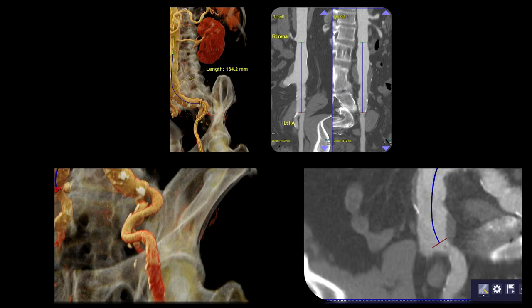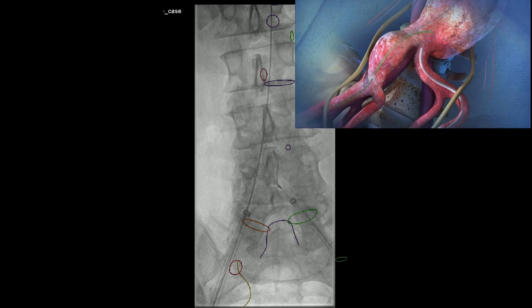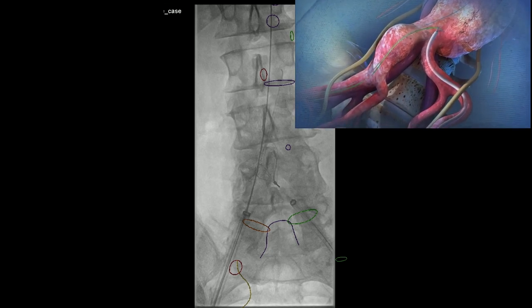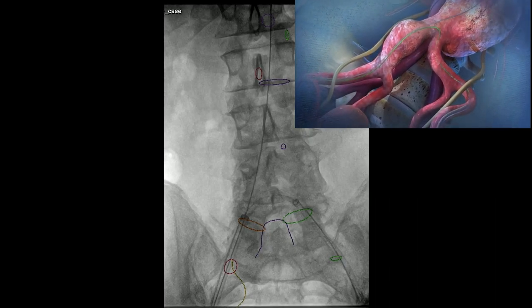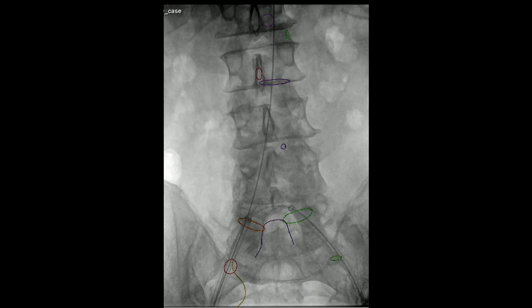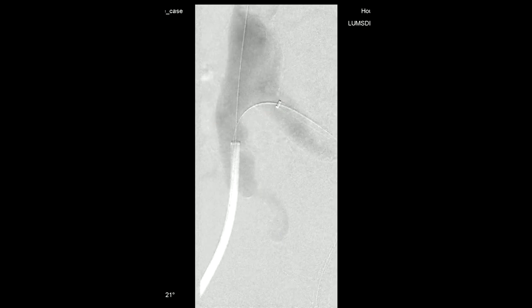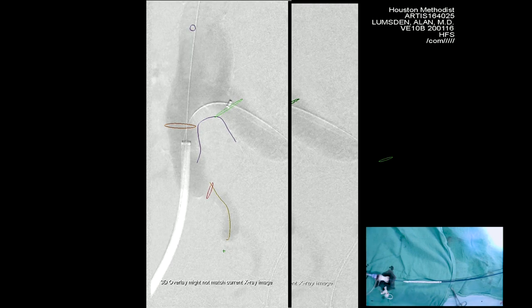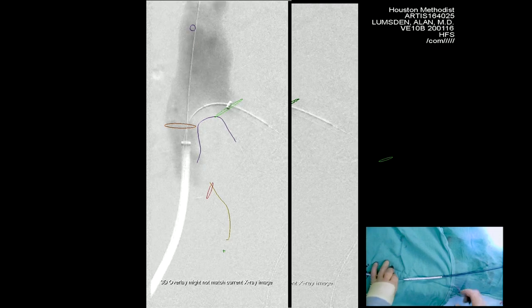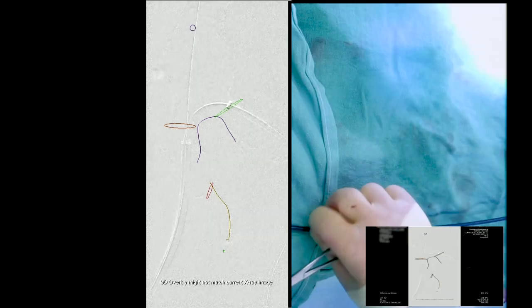We accessed both sides and placed wires. Here you can see the centerline measurements which allow us to plan the device. There's an 18-French sheath on the right side and a 12-French sheath on the left side. A stiff wire has been placed up the descending thoracic aorta, and a second wire — an 035-260 glide wire — has been snared from the left-sided 12-French sheath access. You work together feeding the wire so you don't cut through the bifurcation. The retrograde injection confirms the markings. By convention, we fuse the preoperative CT scans and depict right-sided marks in red and left side in green, so you can see the origin of the left common iliac artery, the take-off, and the centerline of the internal iliac artery. The fusion marks are beautiful here, and we chose the gantry angle for opening up the iliac based upon the pre-op CT scan.